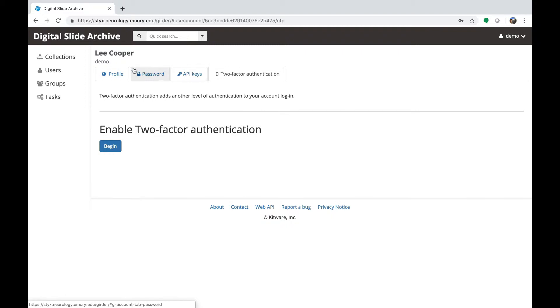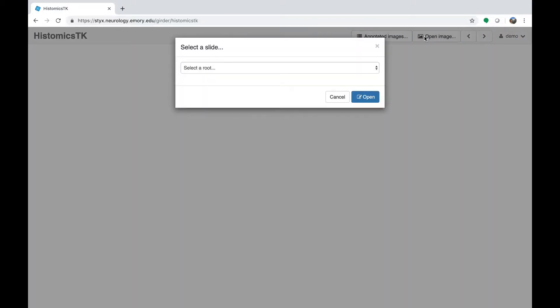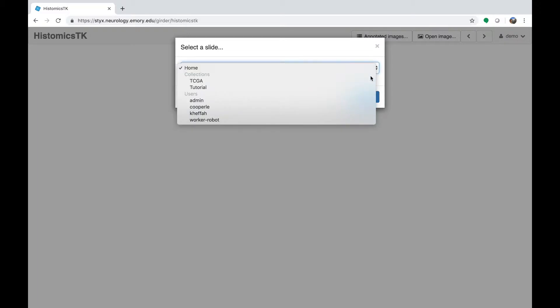You can click on the Digital Slide Archive logo at any time to go back to the landing page. The main link you're going to use to access your slides if you're performing annotations is the bottom link that says HistomicsTK. Go ahead and click on that link, and that will take us to a blank page. To open an image, navigate to the button that says Open Images and click it.